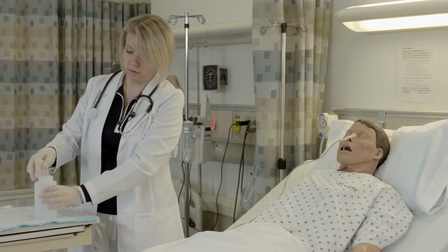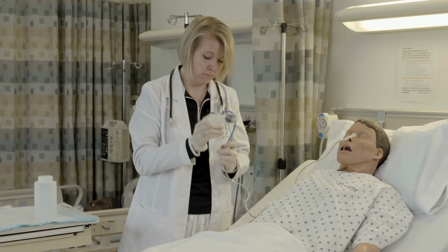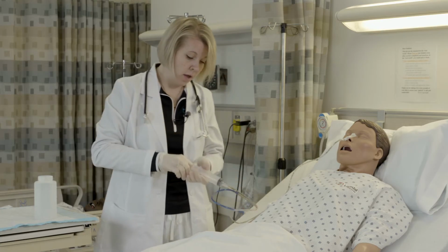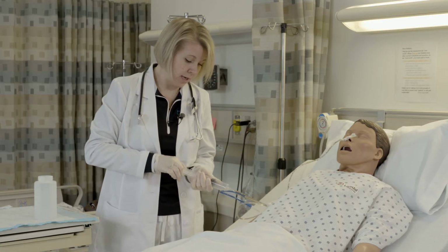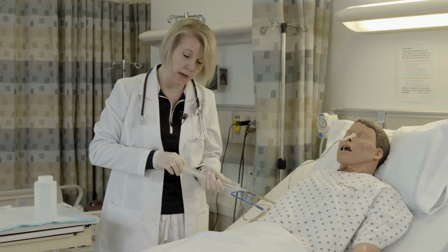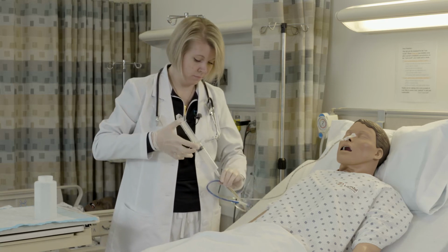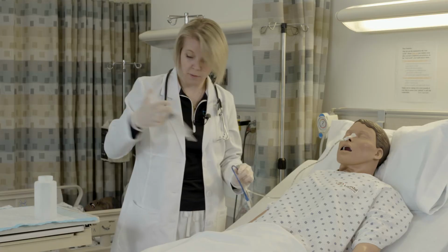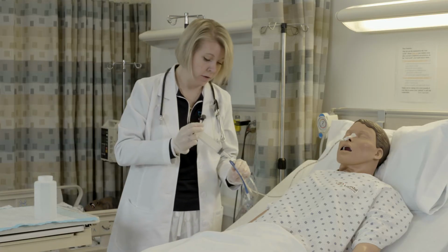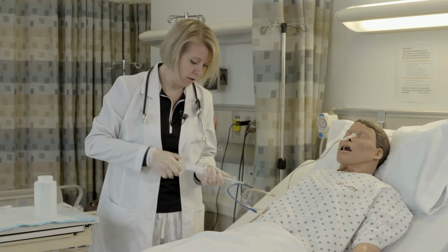So we're going to do that by taking our syringe, inserting it into the NG tube, and pulling back the gastric contents. As we're pulling back the gastric contents, we're checking for the volume. We're also checking for color. So after we pull back, we can insert it into our container. And we're going to do this until there's no gastric volume coming back.